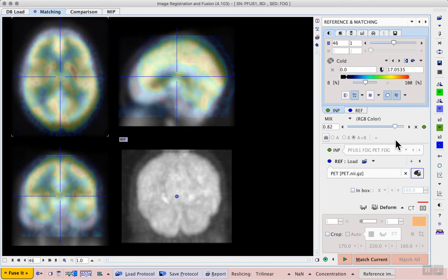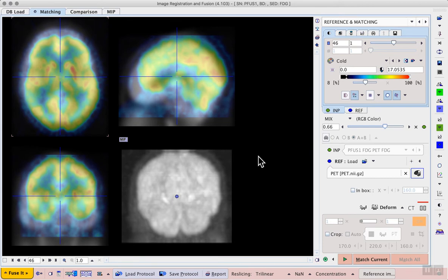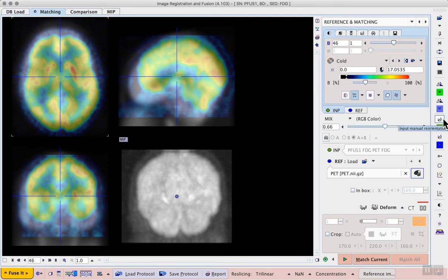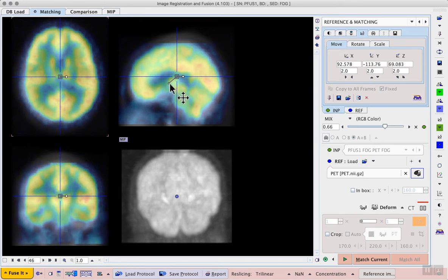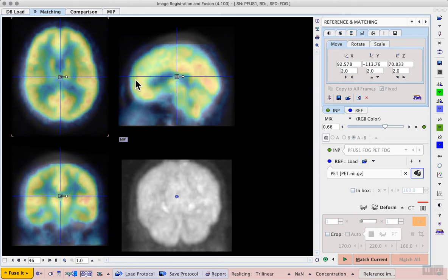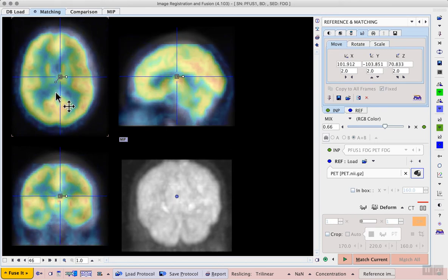Again it's not always necessary if you want to perform batch processing or just move through the workflow quickly, but we can very easily see these translation mismatches so from the right hand side we can select the input reslicing tools and then we can easily use those controls to improve the initial alignment making it easier for the algorithm to find the first affine transformation before doing any elastic matching.